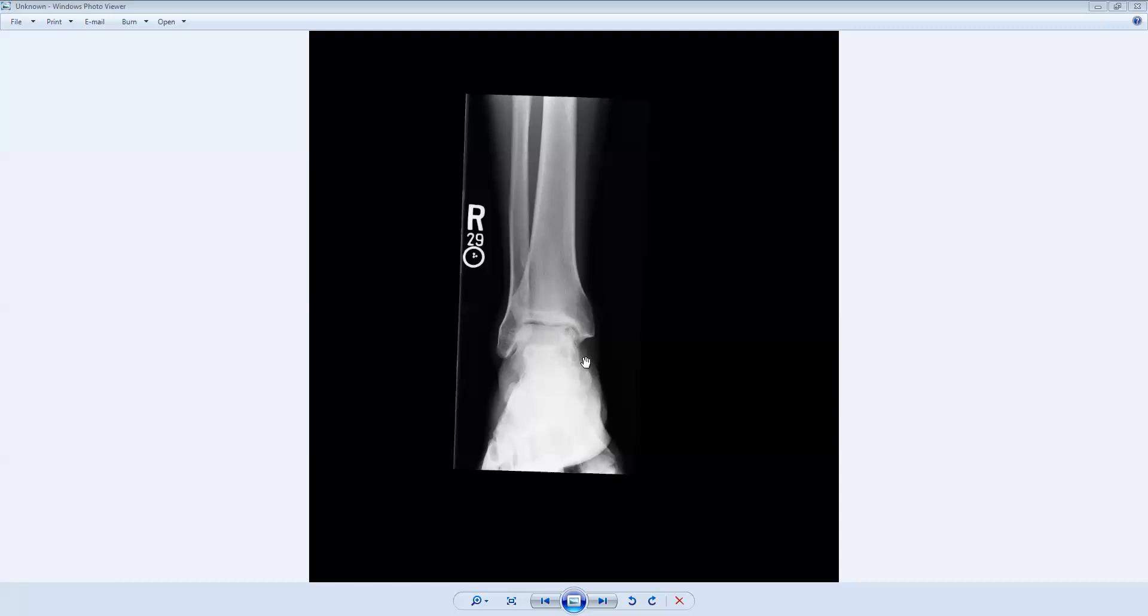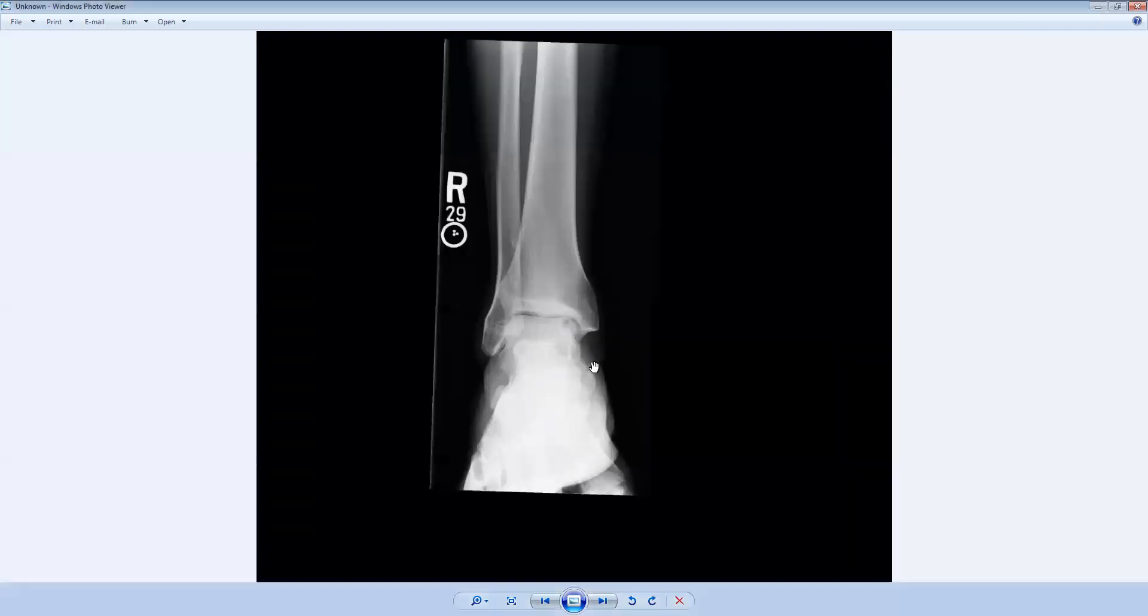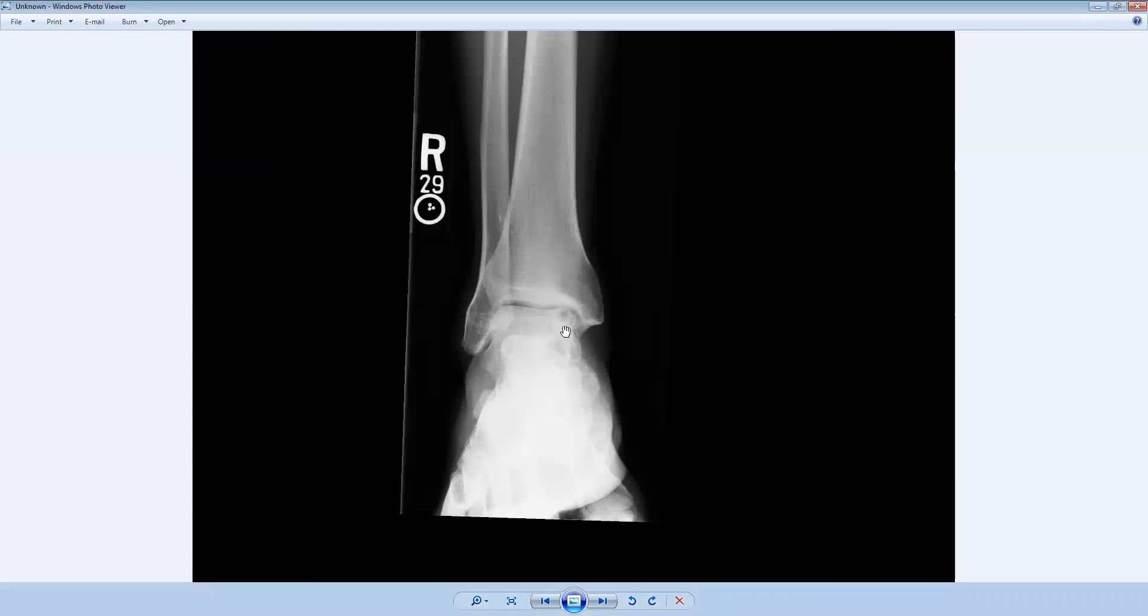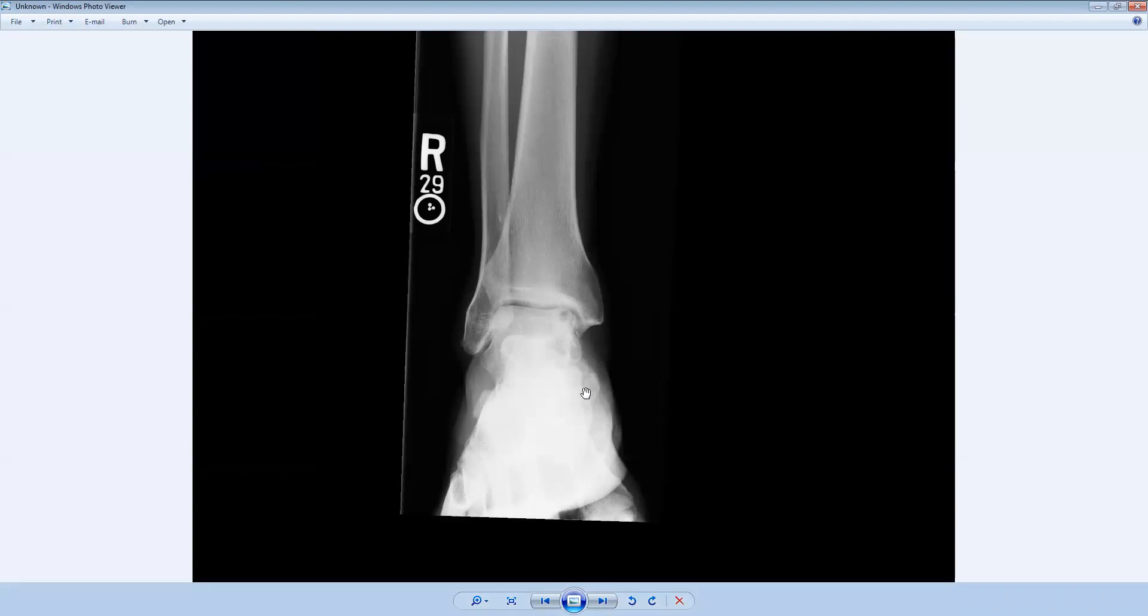But the finding that we do see in this image is this round area of subchondral lucency just under the medial talar dome. If I zoom in a little bit more, we can see more clearly this area of radiolucency along the medial talar dome. So that's the finding in this case.